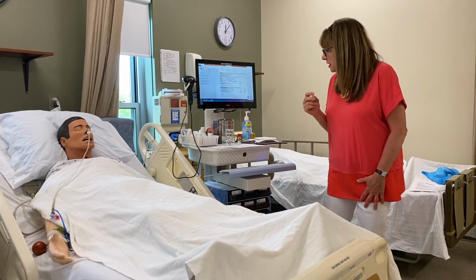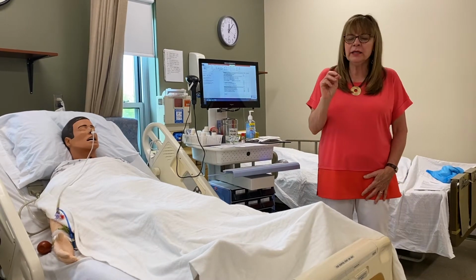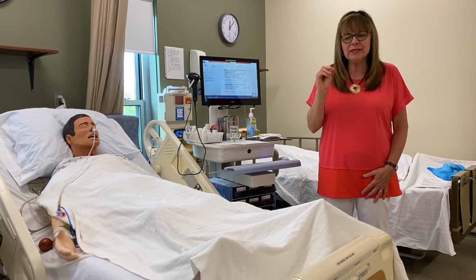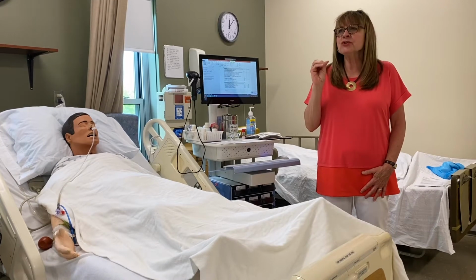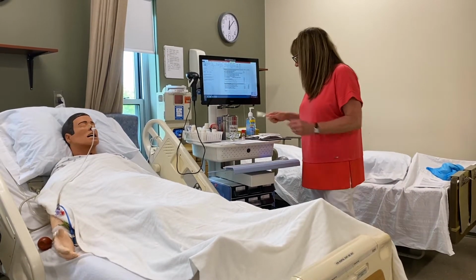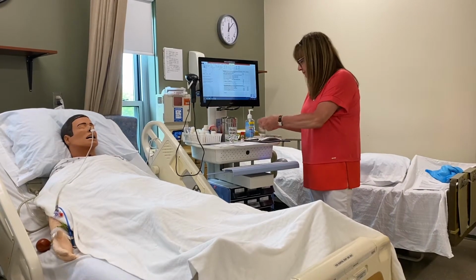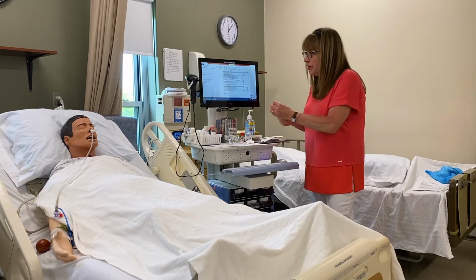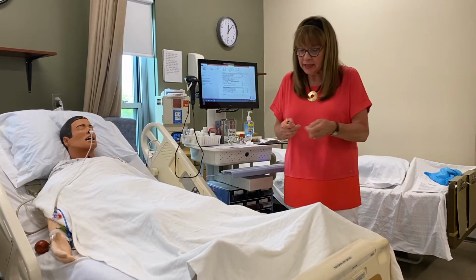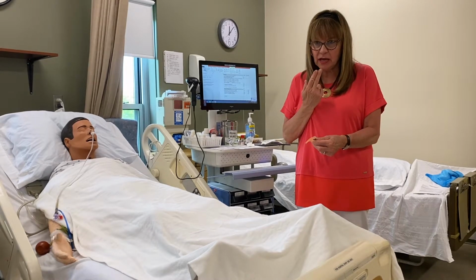The purpose of an intradermal injection, remember, is it's a very fine needle, 27 gauge, 1/4 inch to 1/2 inch. And the bevel of the needle, what that means is the opening of the needle, needs to be facing upwards.